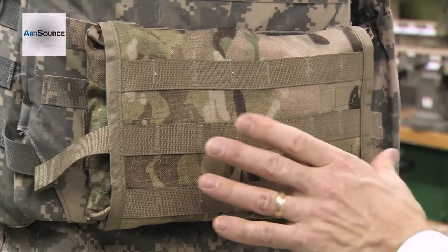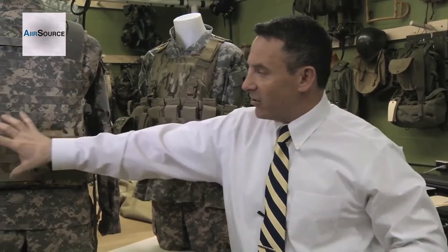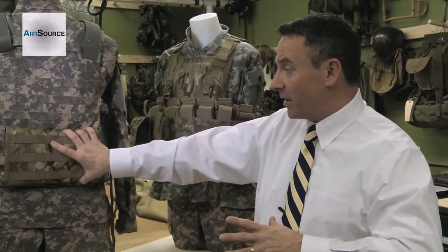So the new IFAC — and we've got this one here mounted on a soldier's individual plate carrier — is mounted in the center of the back. That was one of the areas we looked at for giving a location for the medical equipment.